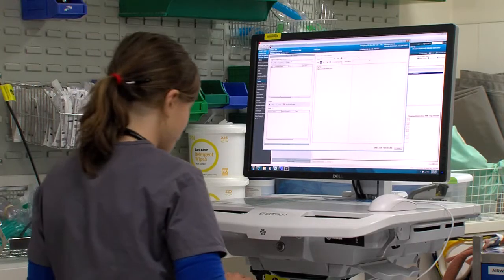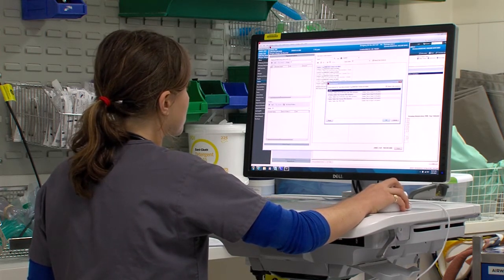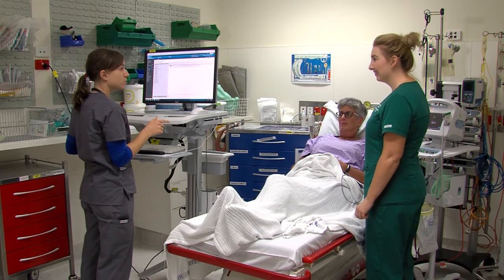When a medical officer has reviewed and ordered any medications for the patient, it is their responsibility to communicate this with the treating nurse. Oh, hi Zara. Hi. Great timing. I've just ordered some Endone for Mrs. Jones.